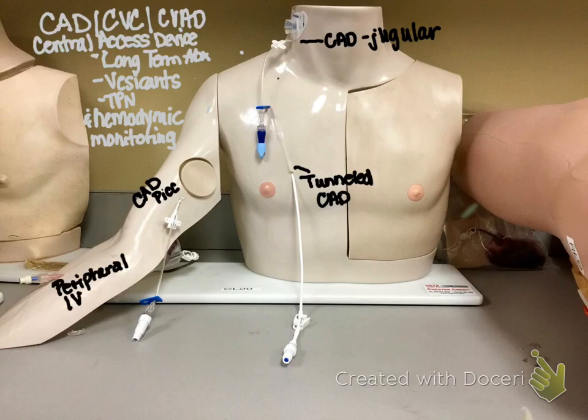And then I just labeled this peripheral IV. Of course, we're not talking about peripherals, but that's what that is. Like I said, this is our chest, and it shows all different lines, but our peripheral IV is there. If you notice on these different lines, they all have caps. This one's blue, the blue and light blue, and I told you about the light blue one being a decreased infection.